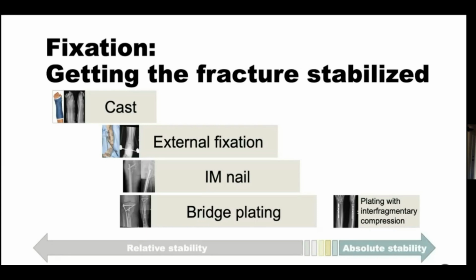And then from an absolute stability perspective, plating with interfragmentary compression is really the best way to provide absolute stability. So this is where you have the very least strain or motion in the fracture environment following fixation.